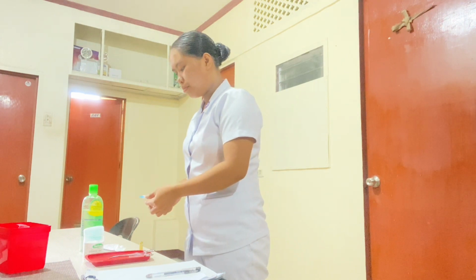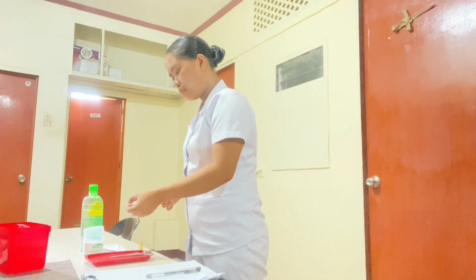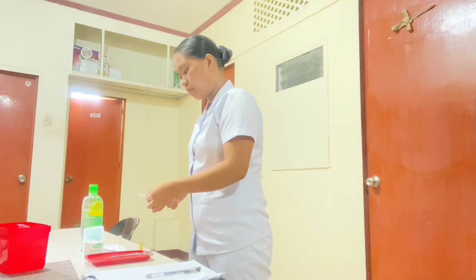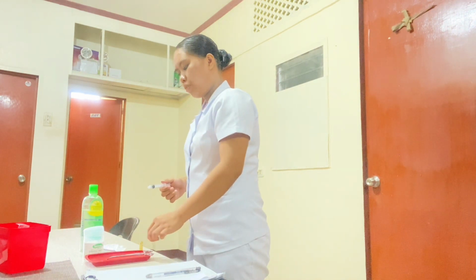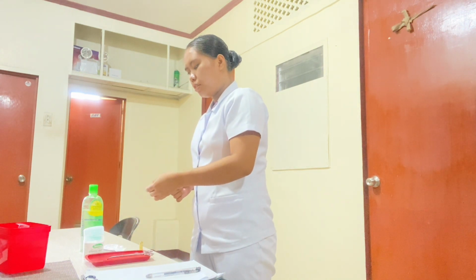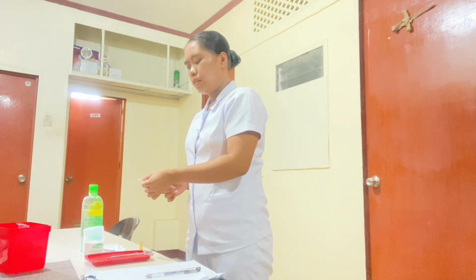After that, remove the filter needle and throw it in the sharps container, and attach another needle that is the correct size for the syringe.